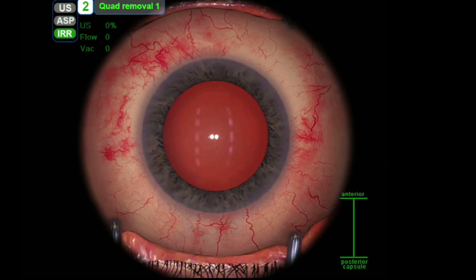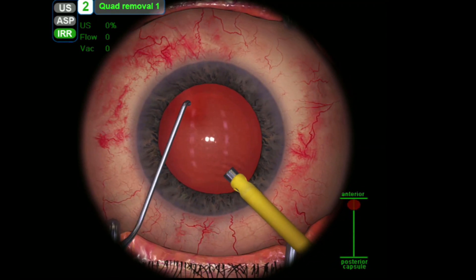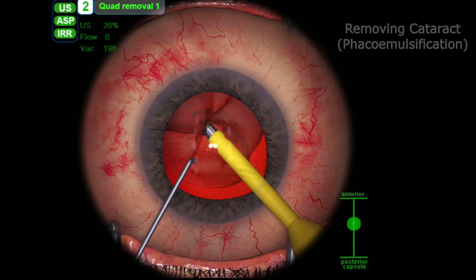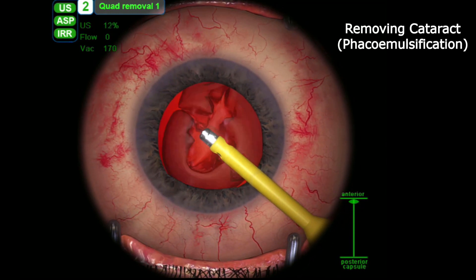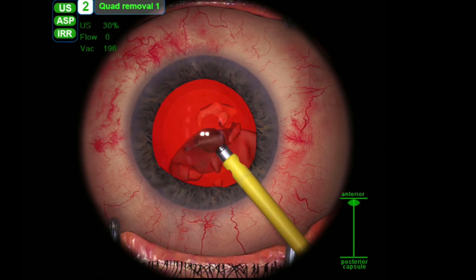The next step is removing the cataract. The yellow probe I'm using in my right hand is using ultrasonic energy and a vacuum to break down and remove the cataract. In this example the cataract is not very dense and it comes away very easily.